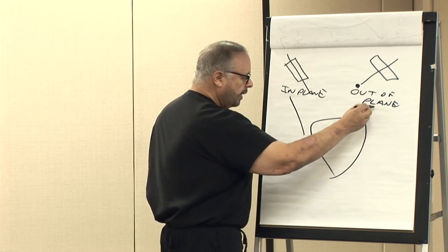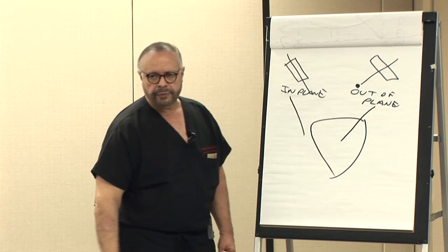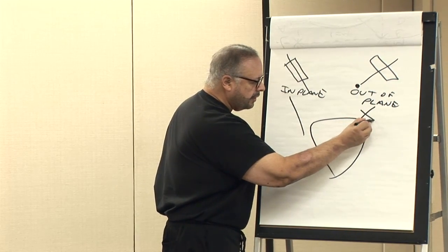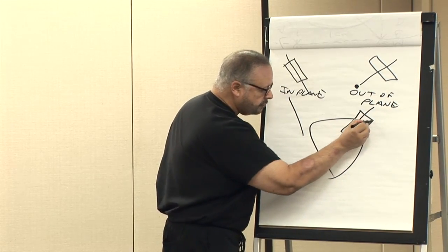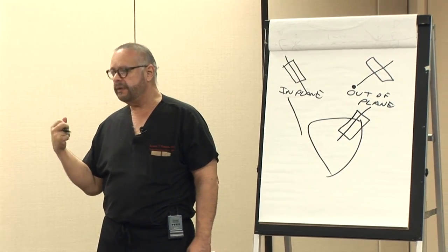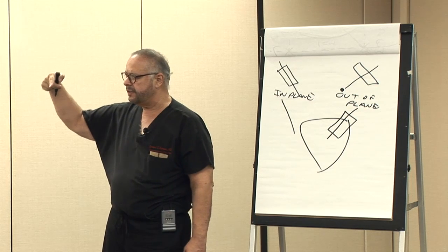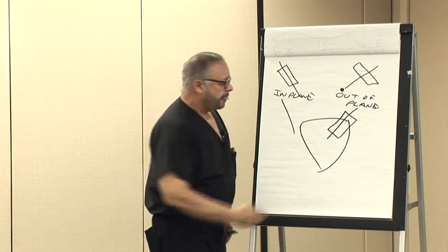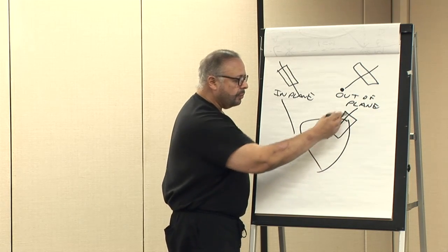If I have my knee here and I'm coming in with a suprapatellar approach, I'm going to have my transducer — the probe — in-plane, in order for me to visualize the needle as it's coming into the intraarticular space.